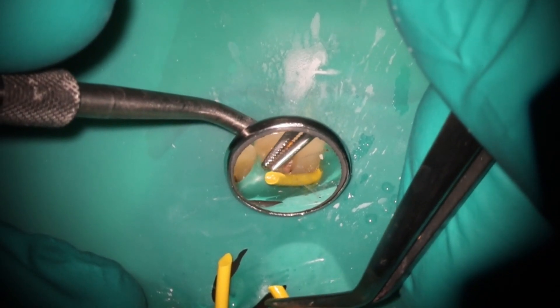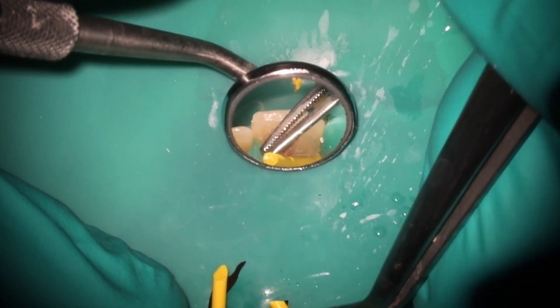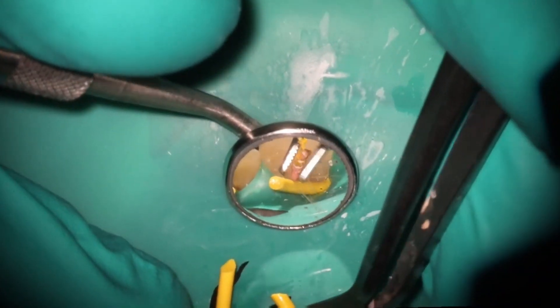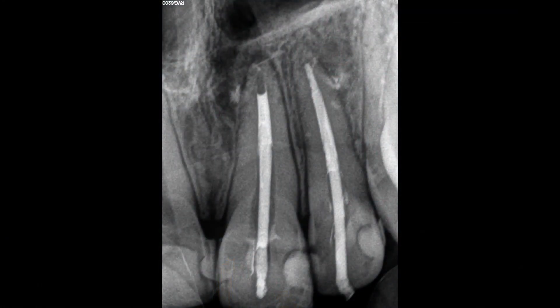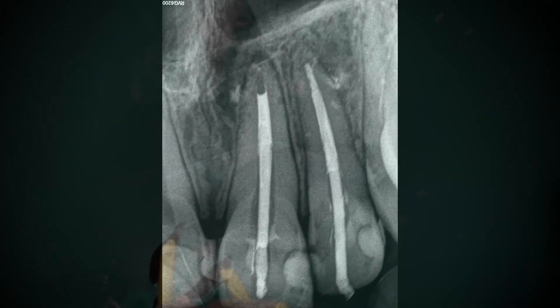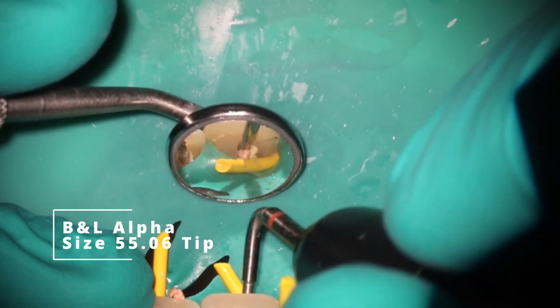I like to use my 08 tapered gutta percha, and I have a taper plate that I cut them to. I forgot the actual size I cut it to — I think it was kind of a larger size to begin with. What I'm doing here is making sure that we're to the length. You always want to go and recheck it after, because oftentimes it's going to push out just a little bit longer each time you do it. There's my check film, and yes, that is definitely short on number 9, but I'm okay with that. With how large this case is, it's going to push down and fill up nicely.